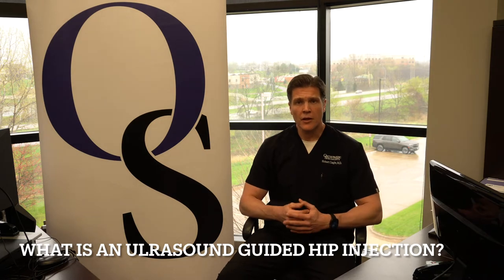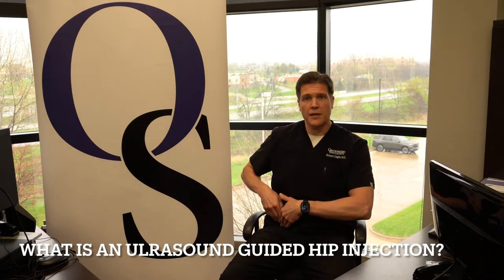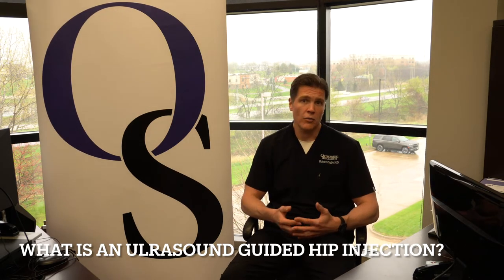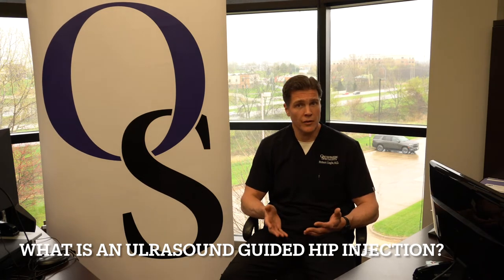To begin, a cortisone injection in general is an anti-inflammatory medication that we direct directly into the hip joint to try to relieve the inflammation, which causes pain around degenerative joint disease, otherwise known as arthritis.